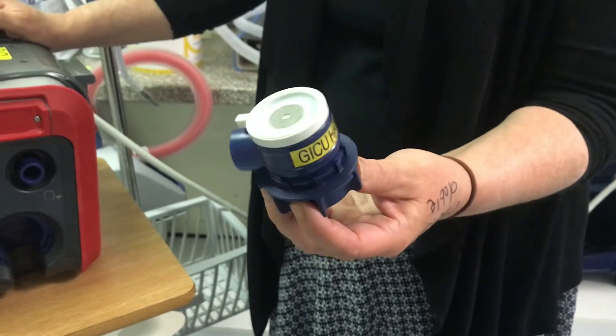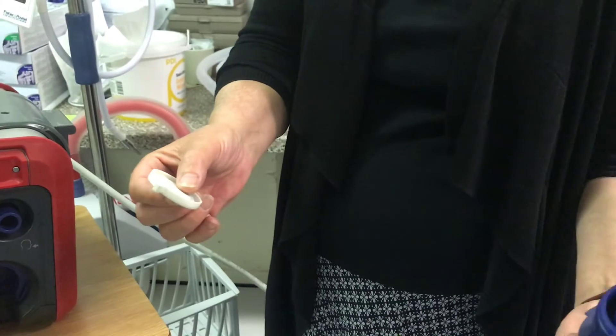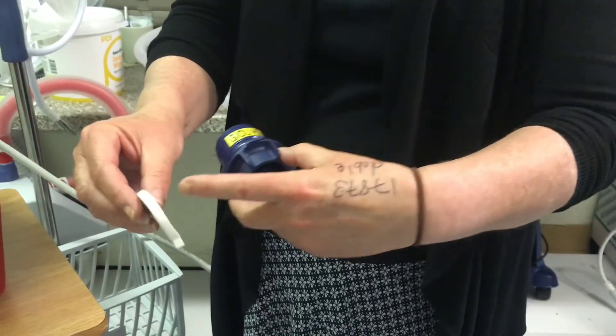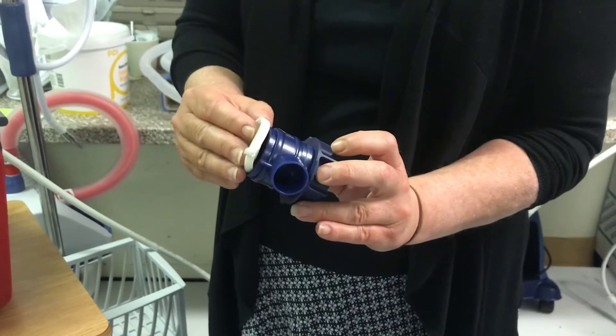However, if you find a valve that is in its component parts, you will have a membrane and the valve. The membrane has a rim here, which fits on top of the rim of the expiratory valve.